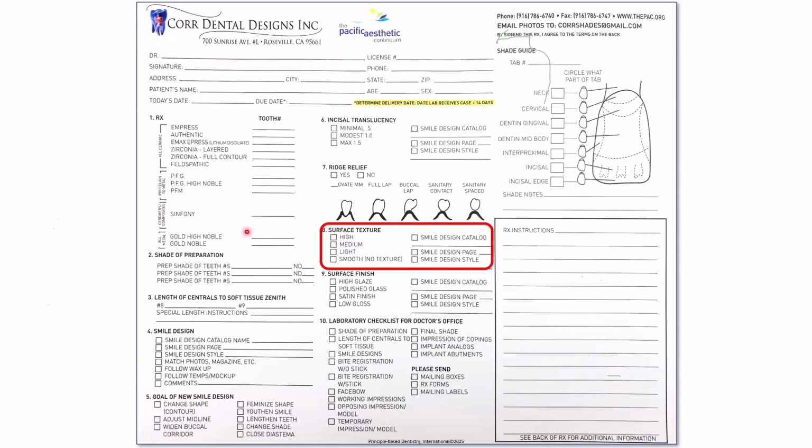in our temporaries, because our temporaries are so accurate that if the lab puts perikymata or whatever surface texture in the diagnostic wax up, that will be reflected in our temporaries and it lets the patient get used to it. So if we envision the patient wants a medium amount of surface texture on their final veneers, we make the temporaries that way.